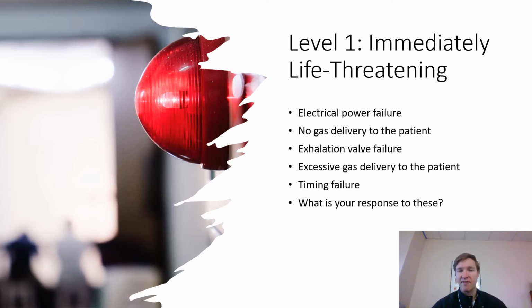But electrical power failure can be life-threatening, because what can eventually happen, especially if they run out of energy, right? Sure enough, the machine can shut off, and there you go. The patient's no longer breathing on life support. They're no longer being supported at all, and it could actually make the patient work hard to breathe just through a circuit without any breath delivery.